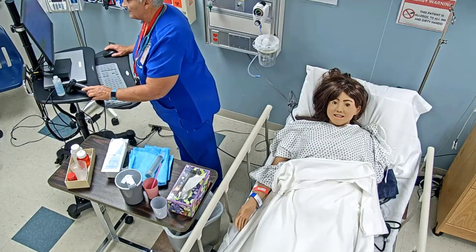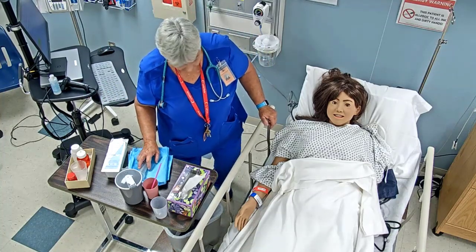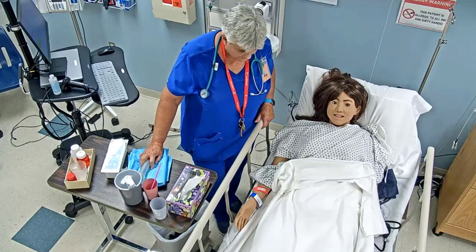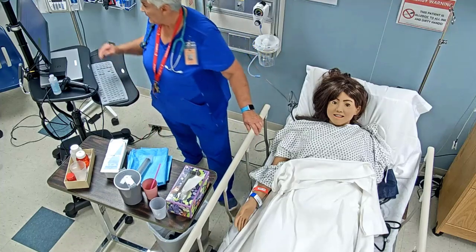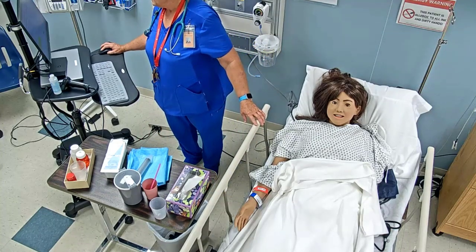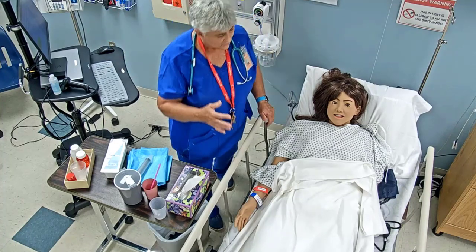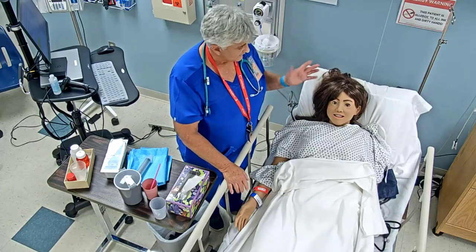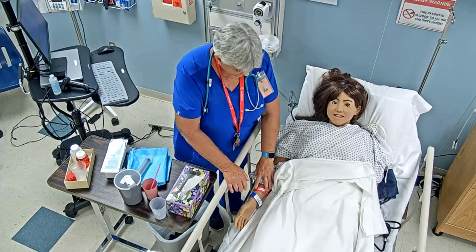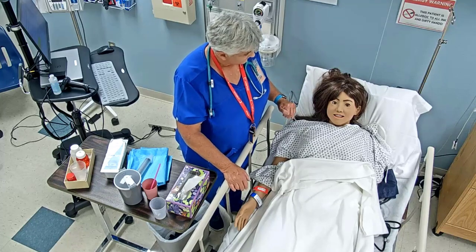So once we've done that, Miss Taylor, we're going to be giving you your medications. I've got some 9 o'clock medications. We're going to be giving them through your PEG tube. I've made sure I provide for privacy. And so we are going to ask your name, date of birth, any allergies. You said no drug allergies, but any other kind of allergies to non-drug stuff?